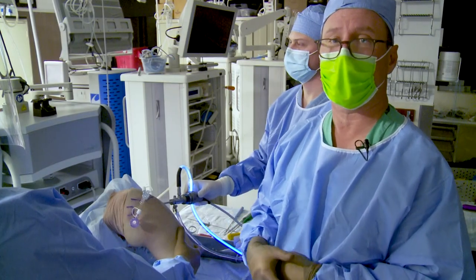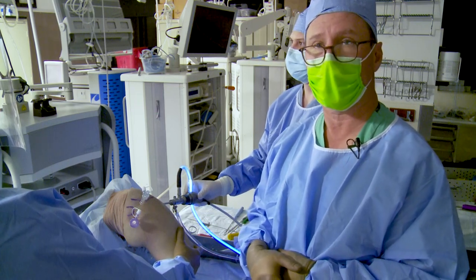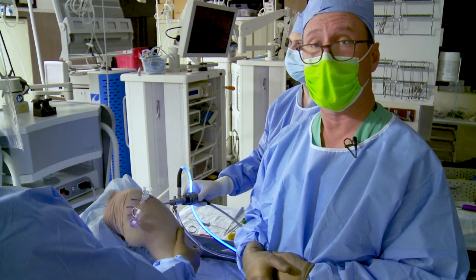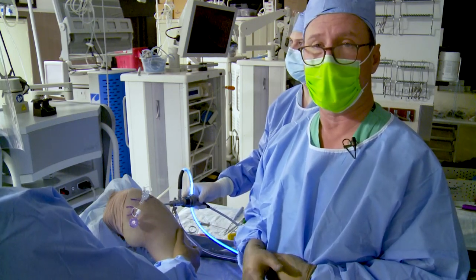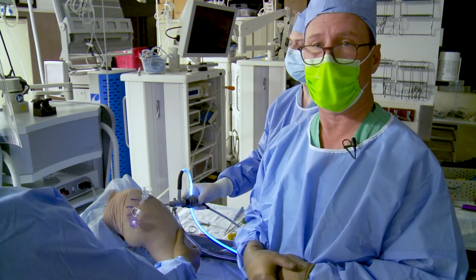Hi, good day. My name is Peter Millett. I'm here at the Stedman Clinic and today we're going to show pearls using the knotless fiber tack, which is a great anchor for the labrum. It's low profile, takes minimal bone resection, and it gives a very nice secure repair.